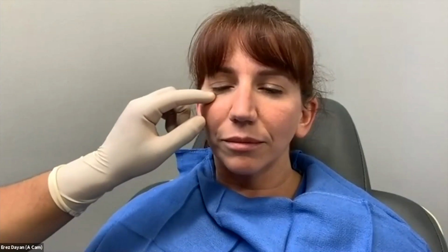So the Accutite is 6 inches long. It's just long enough that I'm just going to get the target areas I want to hit. And it's a very kind of convenient way of doing it. So for the lower lid, I'm not actually going to do lower lid on her because she doesn't really need it. But what I would do is here, you palpate the orbital rim. It's kind of right there. Just come lateral to it, so like right here, basically.